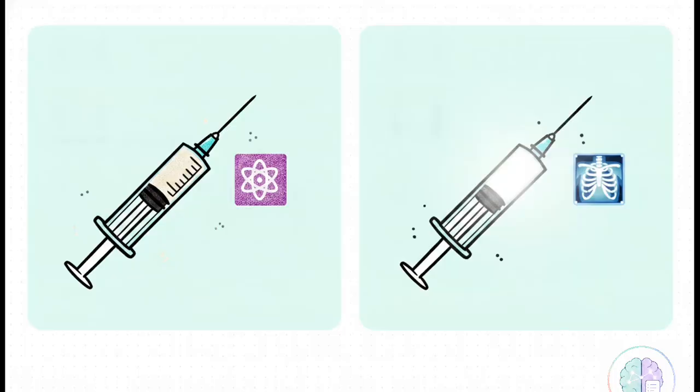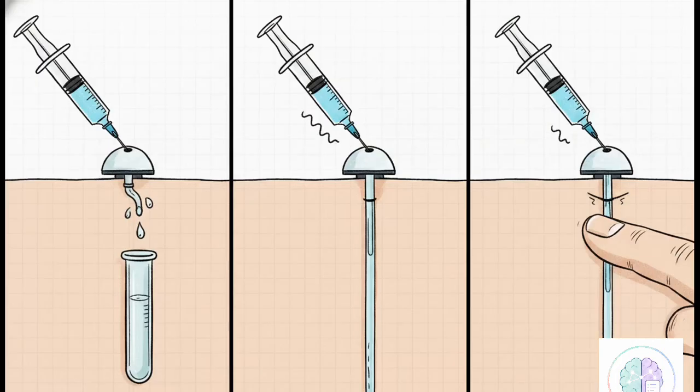The core difference here boils down to the material you're injecting. A radionuclear shuntogram is a nuclear medicine study. You're using radioisotopes, specifically something like 1 millicurie of 99m technetium pertechnetate. On the flip side, an X-ray shuntogram relies on iodinated contrast. For that, you'd inject an agent like iohexol, which you probably know as Omnipaque 180, and follow it up with standard radiography.